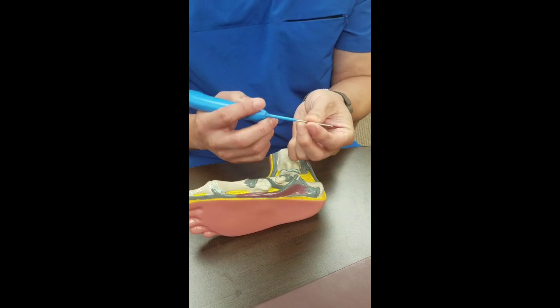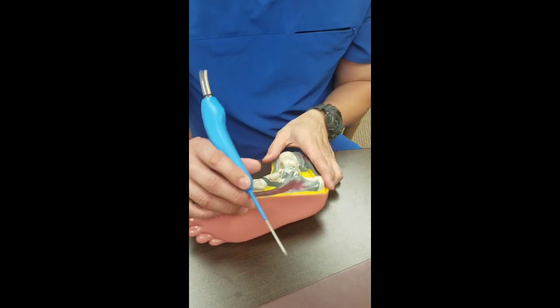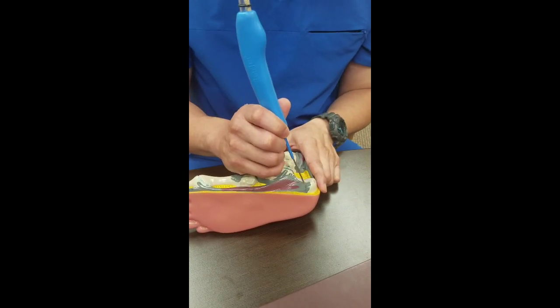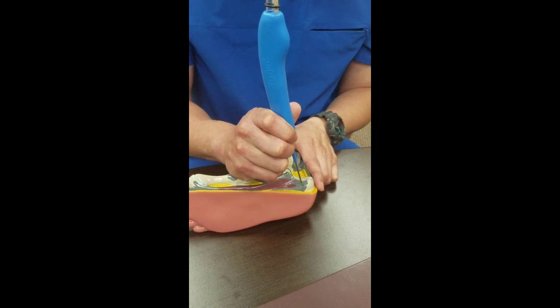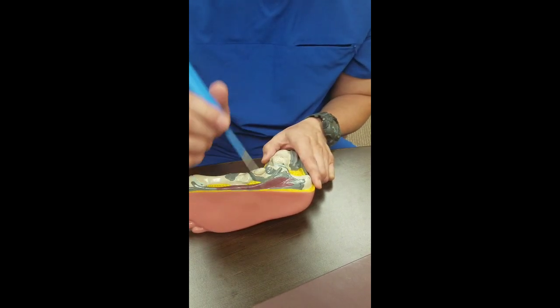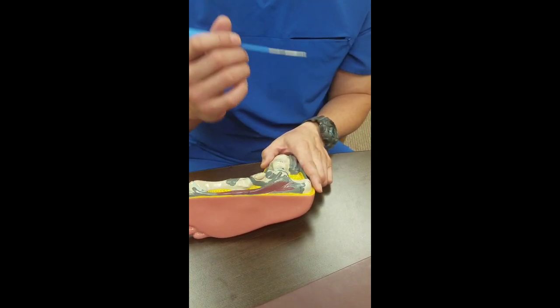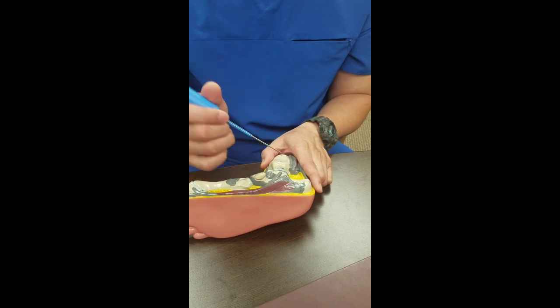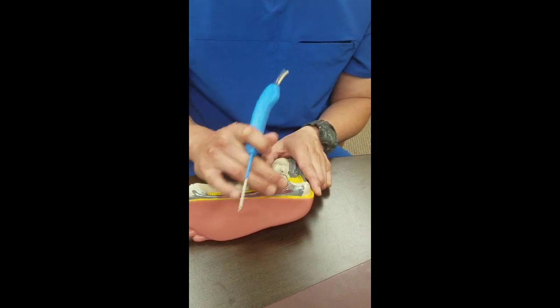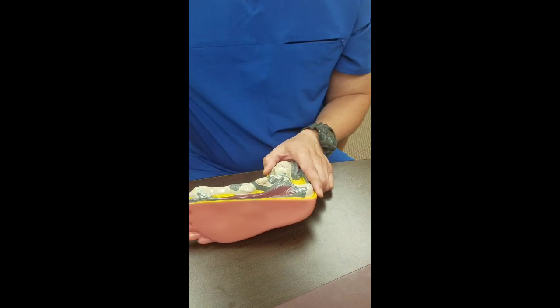It's not much bigger than a blood drawing needle, an 18-gauge blood drawing needle, and you're under anesthesia anyway. We're able to go in with a few pokes and take care of this procedure without cutting the plantar fascia. This needle is going into the plantar fascia and just breaking up all the bad, inflamed, pathological soft tissue. What you're left with is a steri strip and a little Band-Aid, and you're walking in a boot immediately. There's no time out.